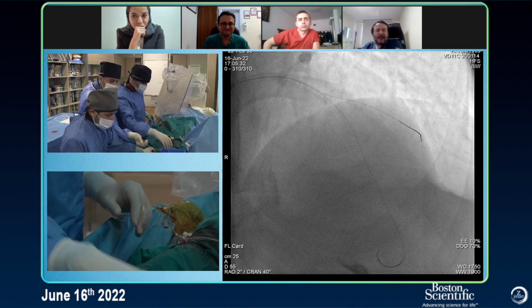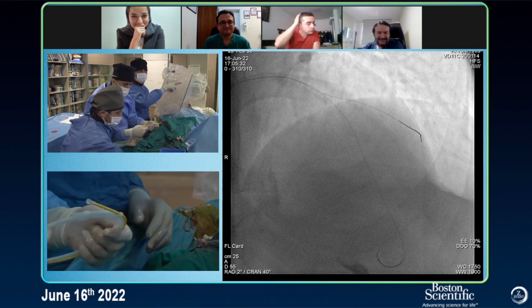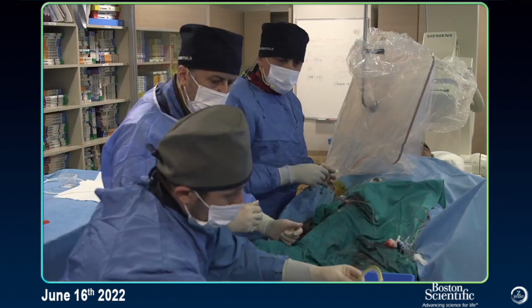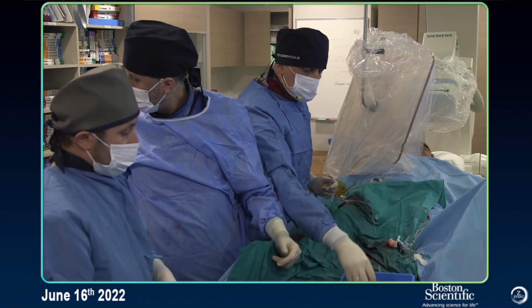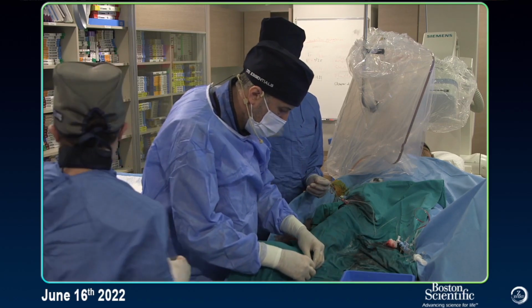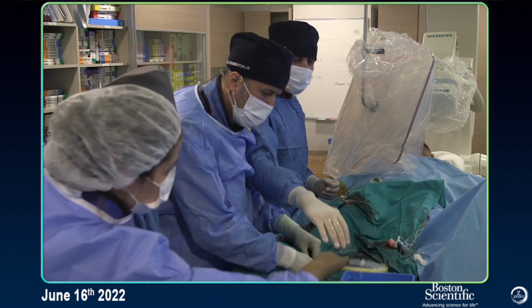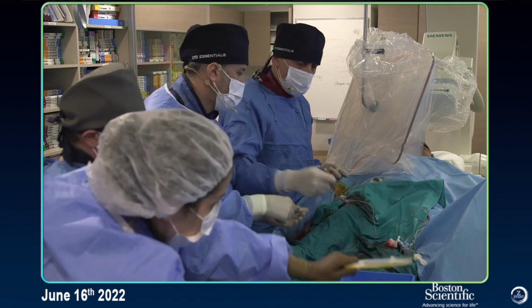When I see you struggling, don't ask her. Let's wire the first diagonal, right? Now, what do you think? Wire. Is there no other wire? Okay, Elif, give him a samurai. Don't let them work on Choice. No, it's okay. Choice is good. I'm not that rich. Shake it. But Elif is rich.